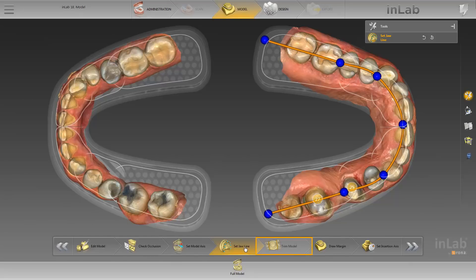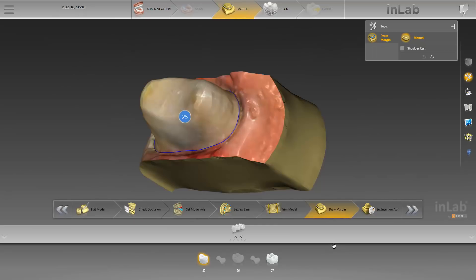Next, the model is trimmed, although this is not a mandatory step when creating a model. The draw margin step, however, is highly recommended. It is worth noting that in the model app, you can check and correct the preparation margin. However, making all necessary corrections now will allow you to skip that step, as the corrected preparation margin will be automatically transferred to the model app. In our case, we have already finished making corrections and will move to the model app.